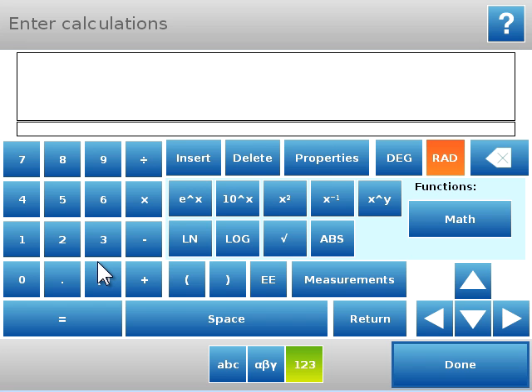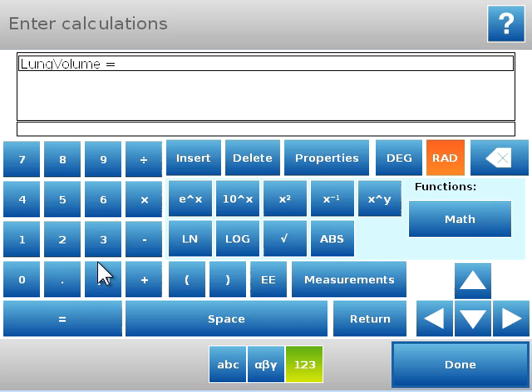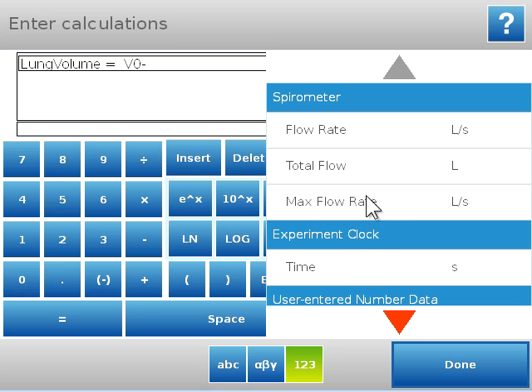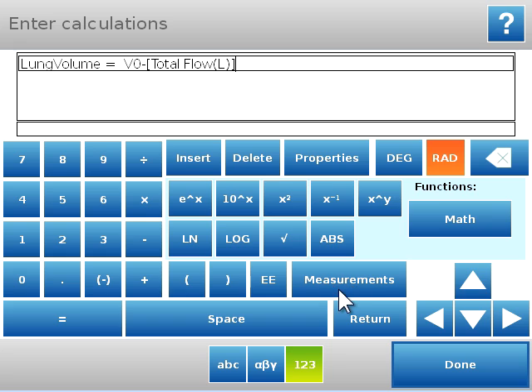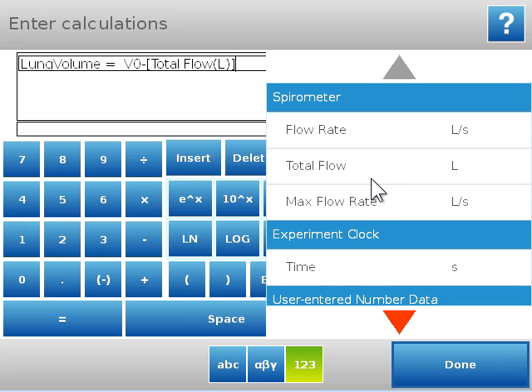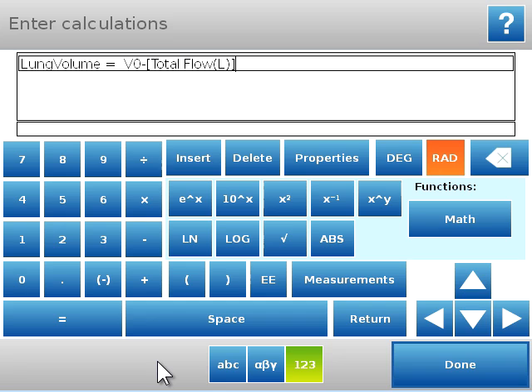I'm going to type in the calculation and then I'll take a few moments to explain it. So I've given my calculation a name, I'm calling it lung volume, and it's equal to V0 minus the measurement of total flow. So you might have noted that when I did this calculation I selected measurements, and I was able to select total flow from measurements.